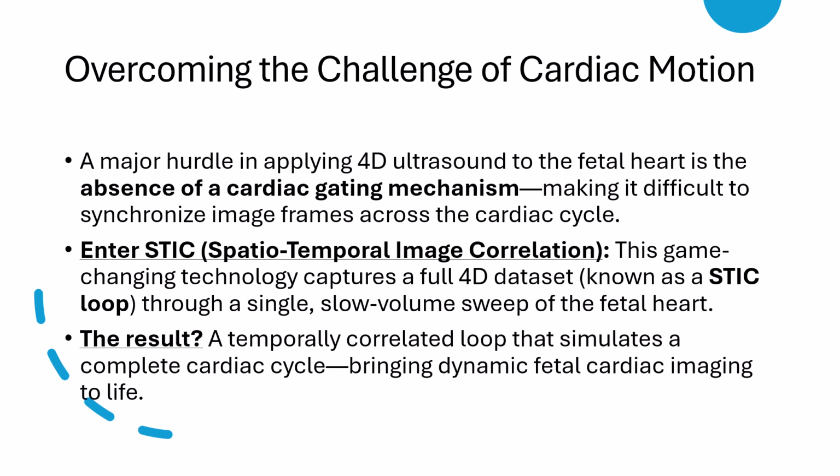The result is a STIC loop, which provides a seamless dynamic view of the fetal heart in motion. By synchronizing the frames across the cycle, STIC eliminates much of the guesswork and variability associated with traditional 4D ultrasound, giving us a true representation of the heart's activity.